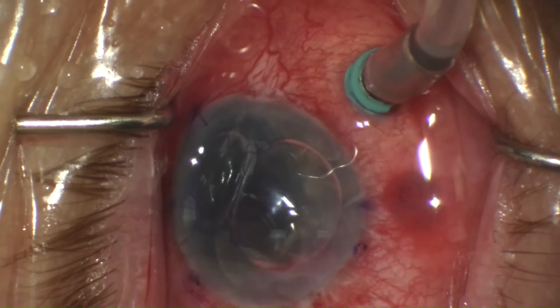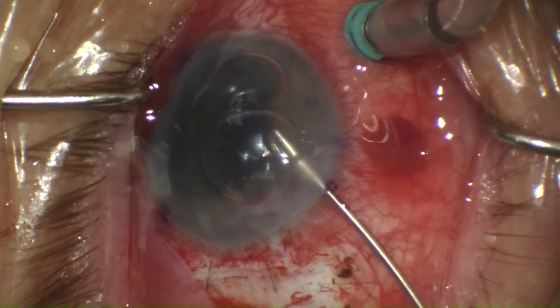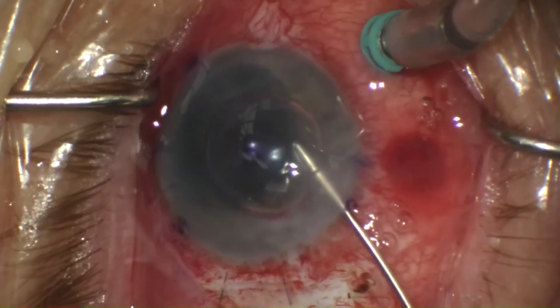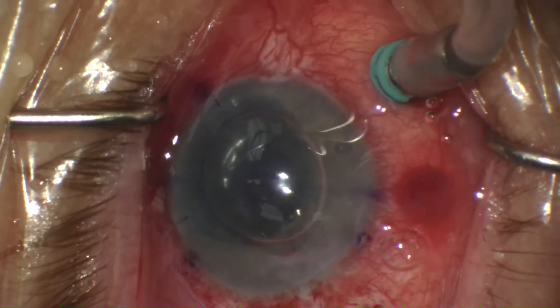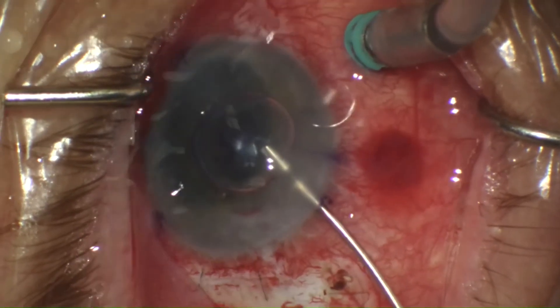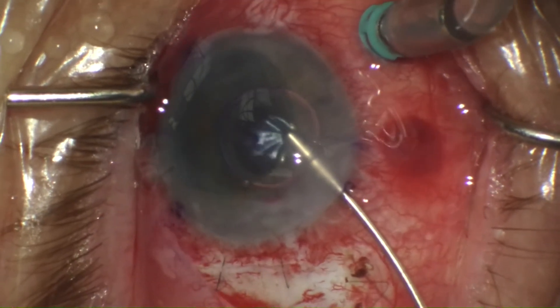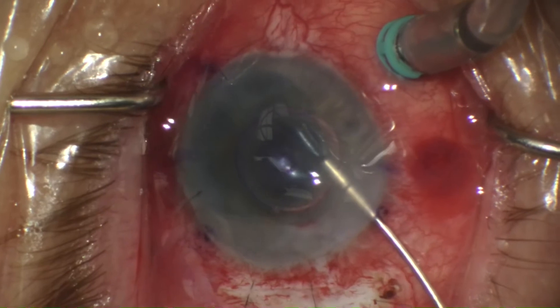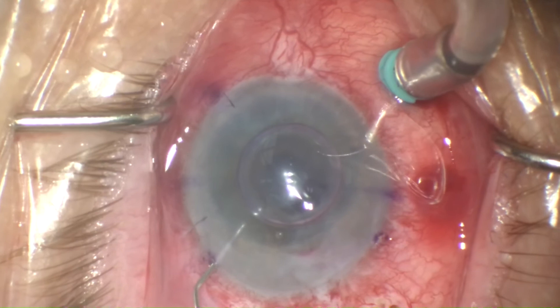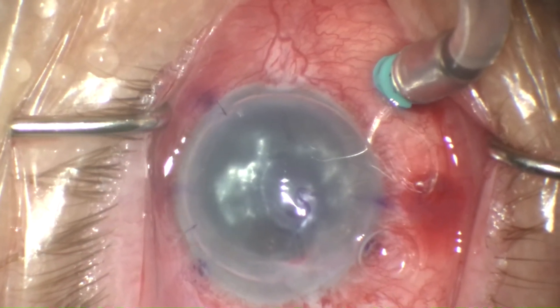You can see the S-stamp visualized in the center, but it wasn't centered well enough, and so I go in with micro forceps and try to get just an edge of the graft. It's kind of tricky to come out and go back in again, and I'm able to capture just the edge of the graft. You can see some striae in the graft as soon as I pull. There you can see the S-stamp coming over, and this allows me to position the graft centrally, then filling completely with air.